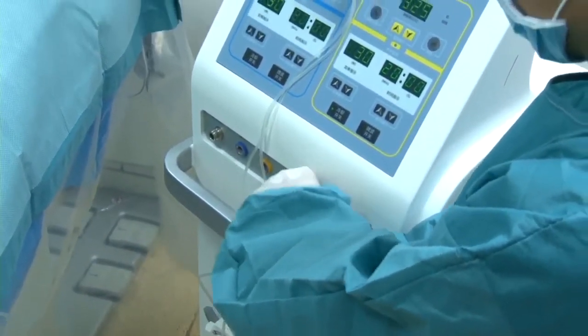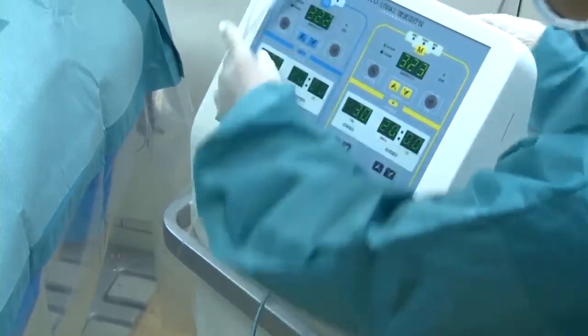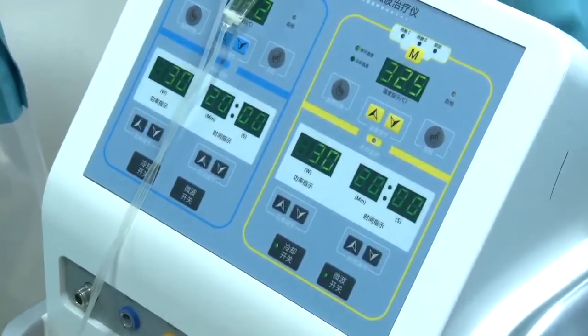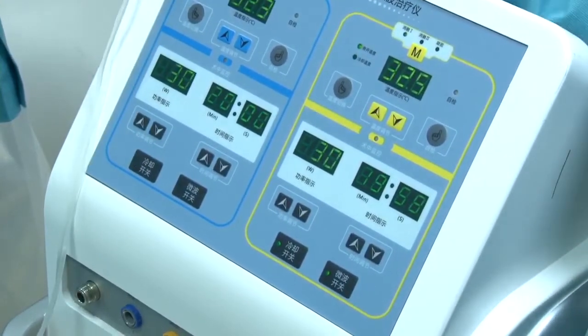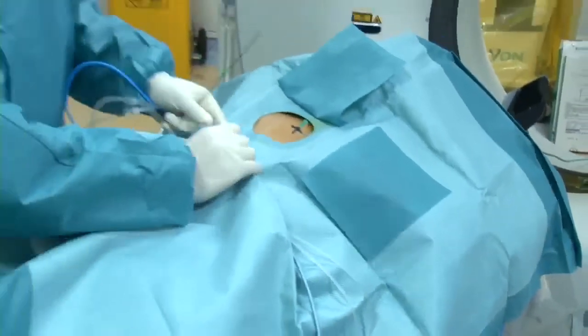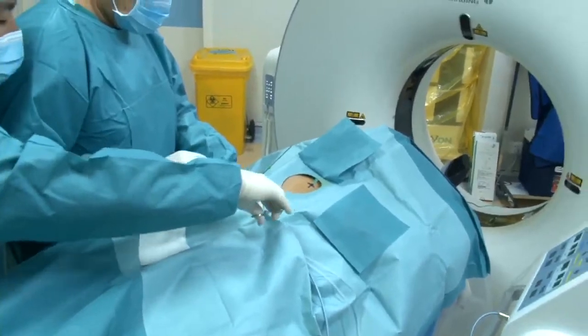I see that this machine has 2 ports, which means that you can do a simultaneous ablation with 2 microwave antennas. Is that correct? Yeah. This machine can connect 2 antennas simultaneously together.